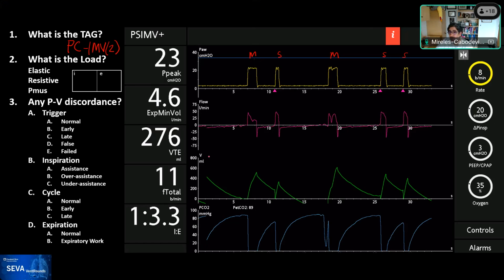But the best way is to use the Rosetta card or the vent mode map, because Rob has spent hours with Ping and the team to figure out when that's happening. In this case, it doesn't. You can see that the pressure is maintained for the spontaneous and the mandatory breaths. It's at the same height. So that also tells us, and actually we know, that this is set point, comma, set point, meaning that we are setting the inspiratory pressure for both. Rob? That covers it. Very good.